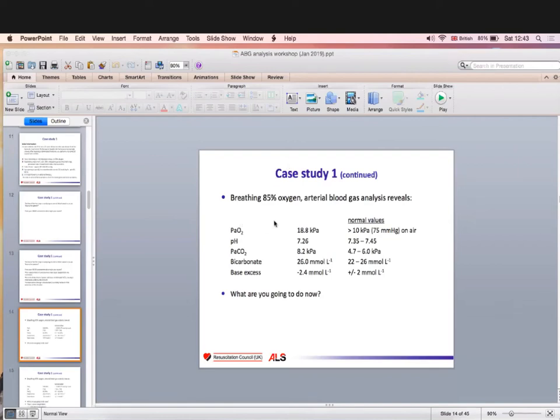In a complete diagnosis, is it necessary to mention the poor oxygenation as well? Oh, yes. When you interpret a blood gas, you have to always comment about the oxygenation. Otherwise, it's inadequate. So you can use the simple rule to assess it.